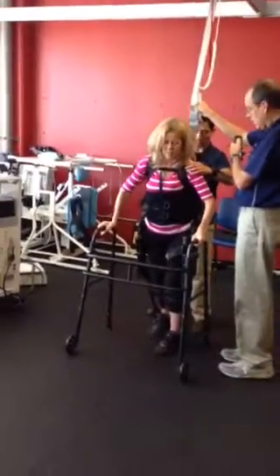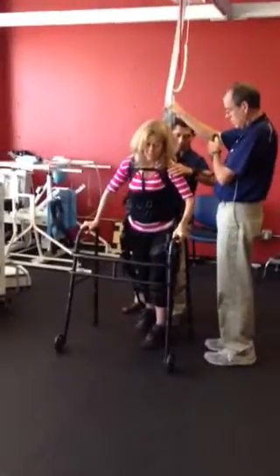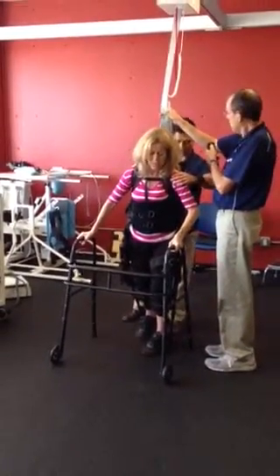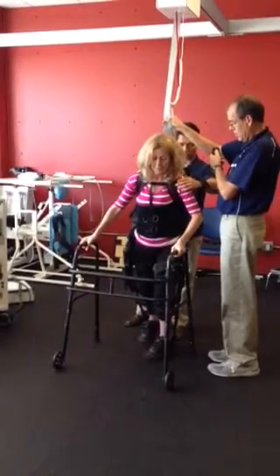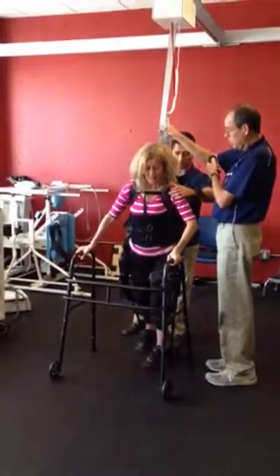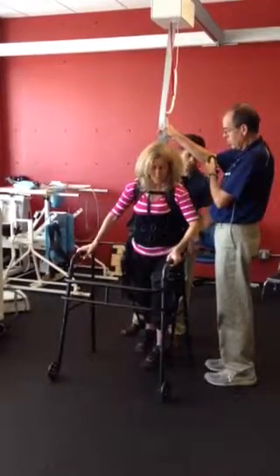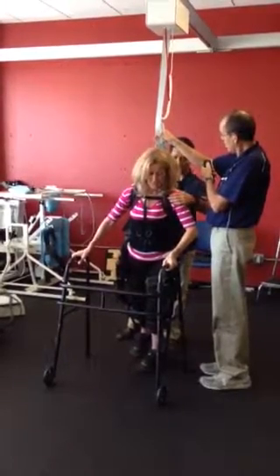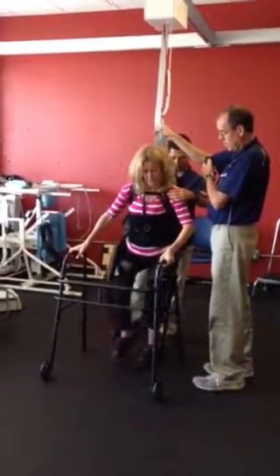Walker. Now let's go lean left. A little more left, so you're over that left leg. Right there. Now the trick here is to hold it. If you don't hold it, it's time to fall to the right. And that means keep more of that weight over the left leg. And step. Good.